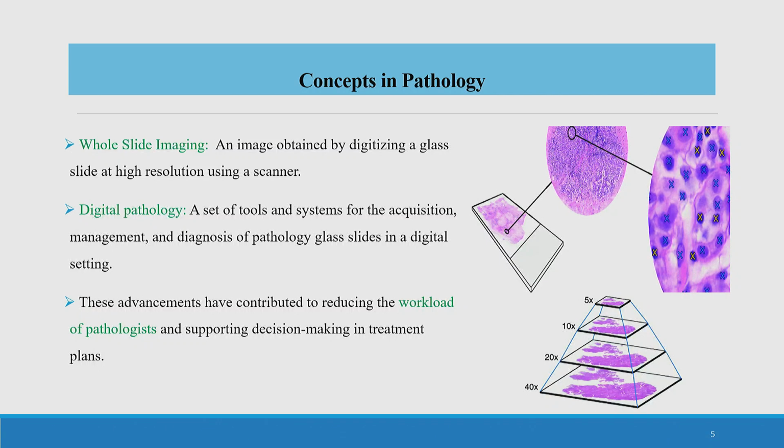So there are high quality, high resolution scanners. Using these scanners, we digitize the slides and we store them, and we apply different kinds of AI techniques, and we process it.